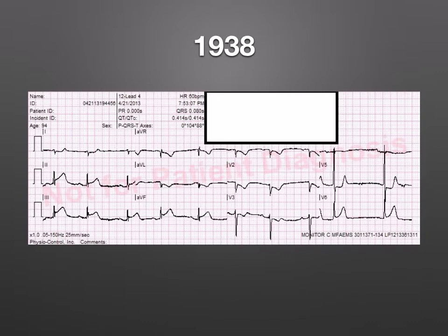And this is not something I think we have to really spend a whole lot of time staring at. Our eyes are drawn down to the inferior leads, and we clearly have some ST segment elevation. We even have some reciprocal changes. So this is a code STEMI because we have a strong story and a strong EKG.